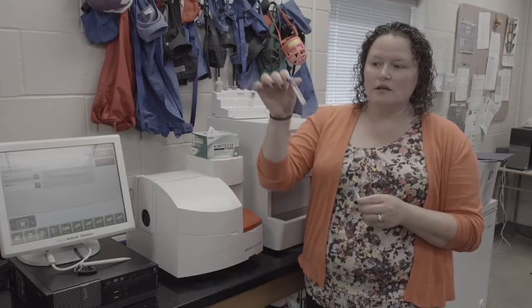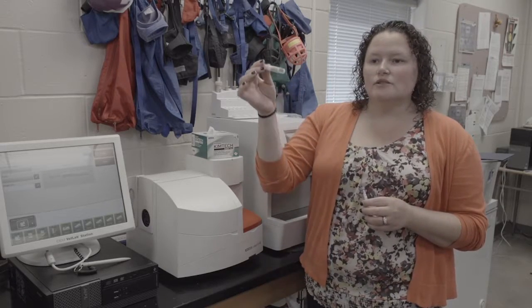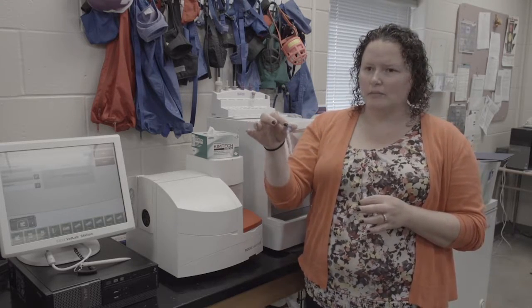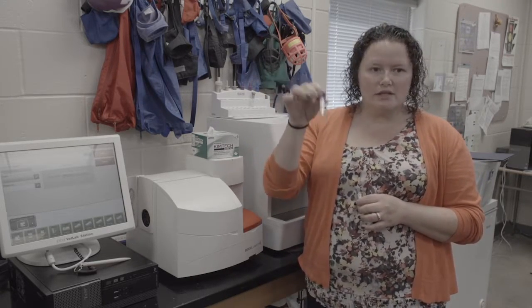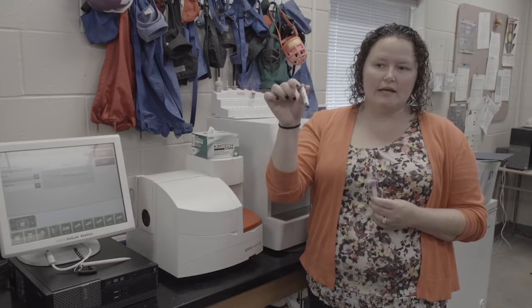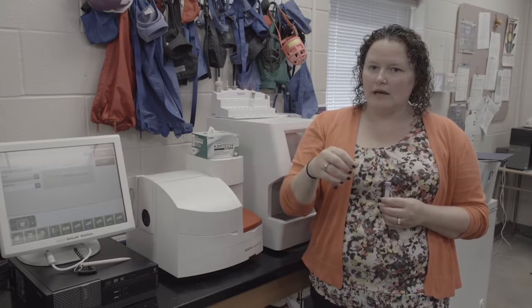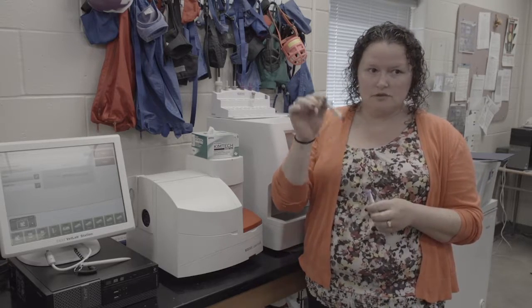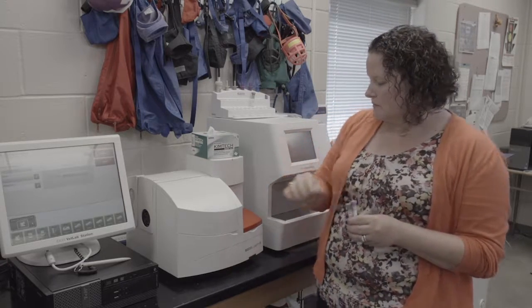That being said, if you didn't mix this or something happened during the run and you didn't get the results you were looking for, or the analyzer had a malfunction, you can rerun the same purple top tube so long as you mix it, but each run needs to have a brand new gray top tube. You cannot rerun these, and you'll see when you pull one out after running it, it's actually full of more fluid and waste. So these are one-time use.